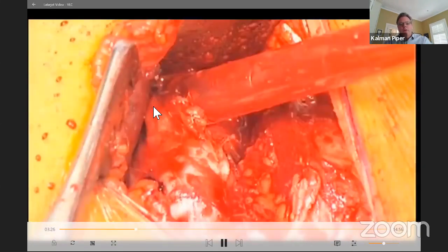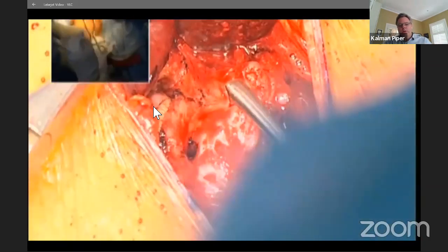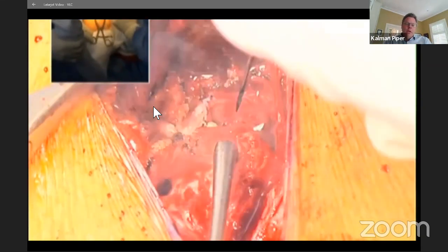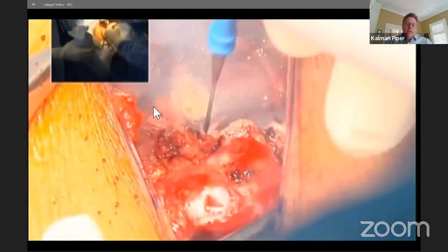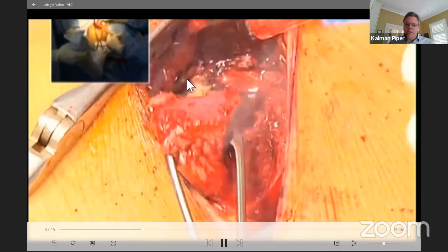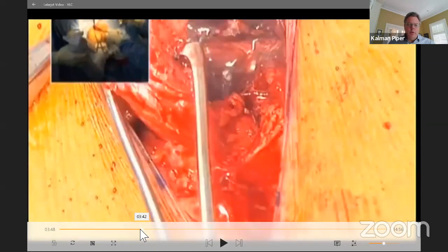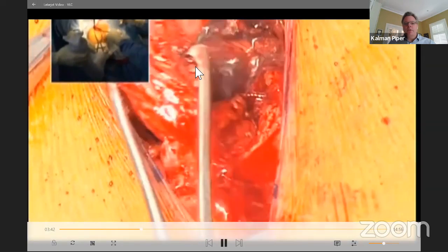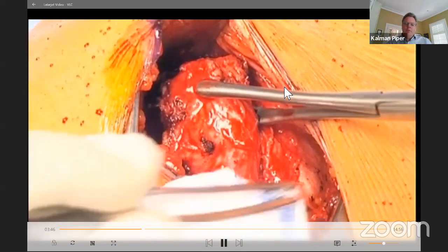Once the coracoid's been removed, you often have still attached to the coracoid graft a little angled bit of bone, which I quite like to see. That means I've got the best possible, the largest size graft. And you'll see that in a moment in this video. Can you see here? Oh, went too quickly. I'll go back just a touch. Just here, he's got the angle right at the base of the coracoid process. So that means you've got a good sized graft.